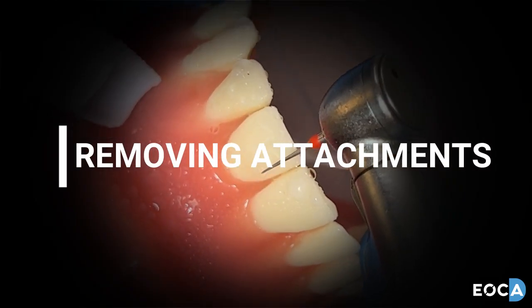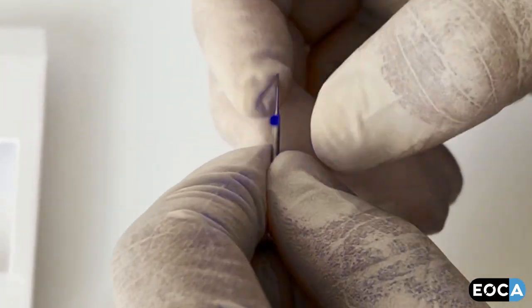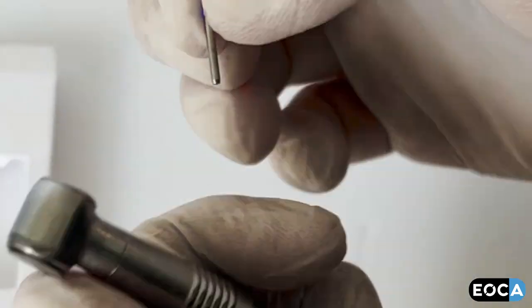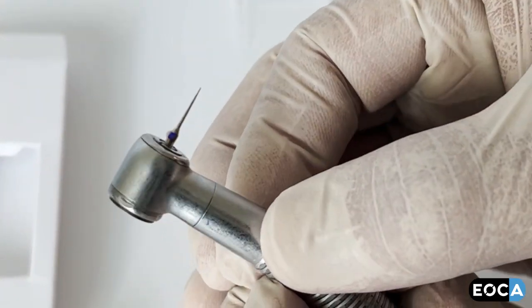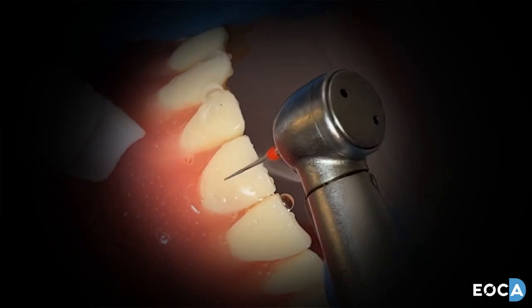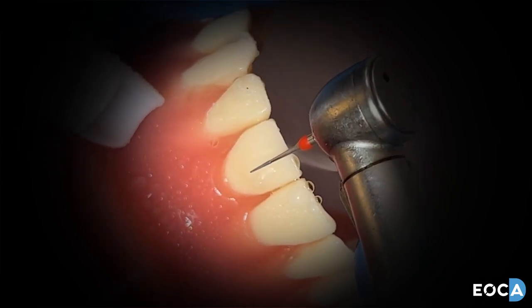When utilizing the burrs for the removal of attachments at the end of treatment, take the blue band burr from the package with tweezers and place into a high-speed turbine using finger pressure only. Gently wipe away the body of the composite attachment until you get close to the enamel.